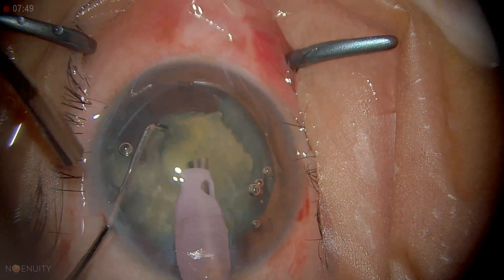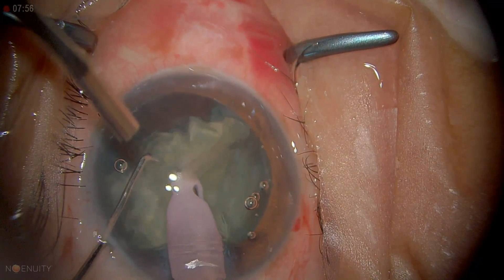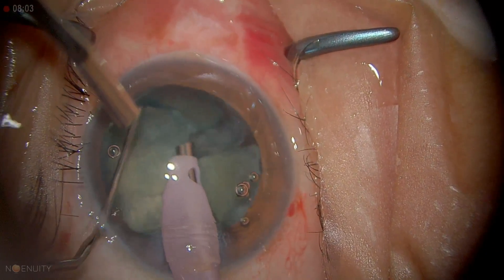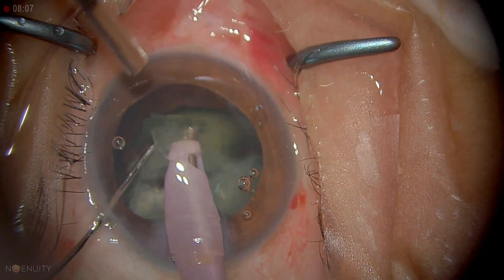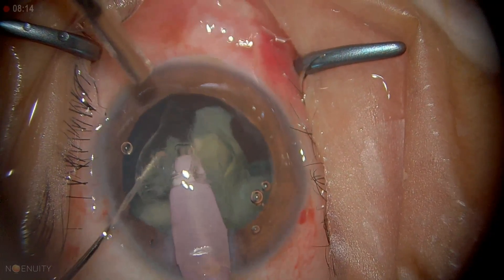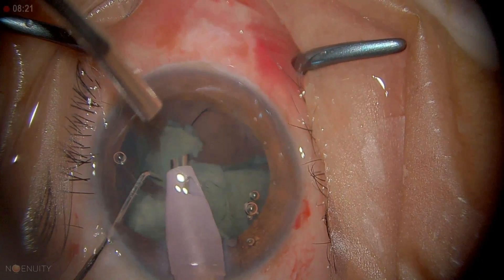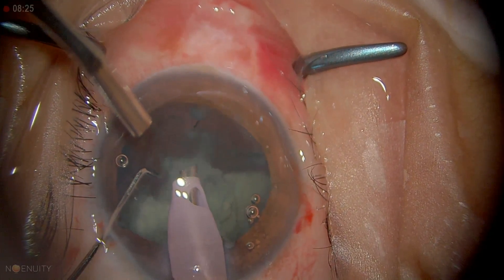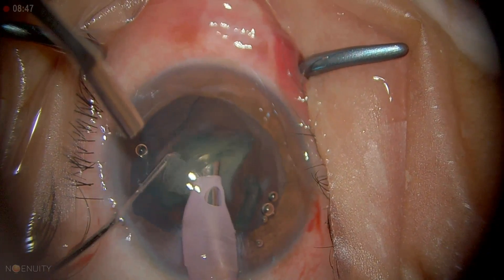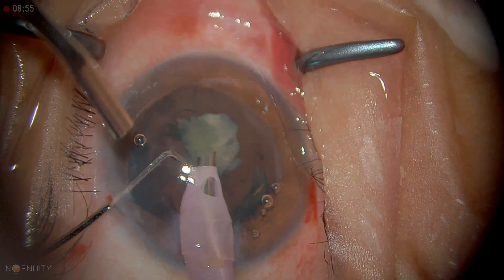It doesn't really matter for this case, but in some circumstances it may be important not to stress the capsule too much. The density is more — especially the central density is quite high — so they don't get chewed up that easily and I need to apply a fair amount of energy. This is the last part, and at this point either I can switch to a lower mode or just continue, but I need to be very watchful because this is the last quadrant. This is the time the posterior capsule can come up.